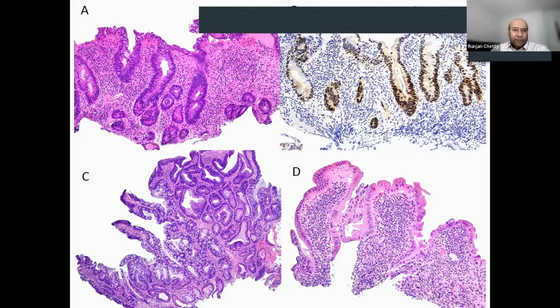So looking at some of the images, this is a conventional dysplasia that we are all familiar with. Again, you can clearly see here that this patient has got IBD because there's architectural distortion, irrespective of the fact that these glands are dysplastic. And you can see that the dysplastic glands have pencillate nuclei, reminiscent of what you'd get in an adenoma. And the process extends right up to the surface. And again, here as well, you can see that the process goes up to the surface. And unfortunately, in this particular section, I can't show you the sharp demarcation between dysplastic and normal mucosa, because it's cut off.